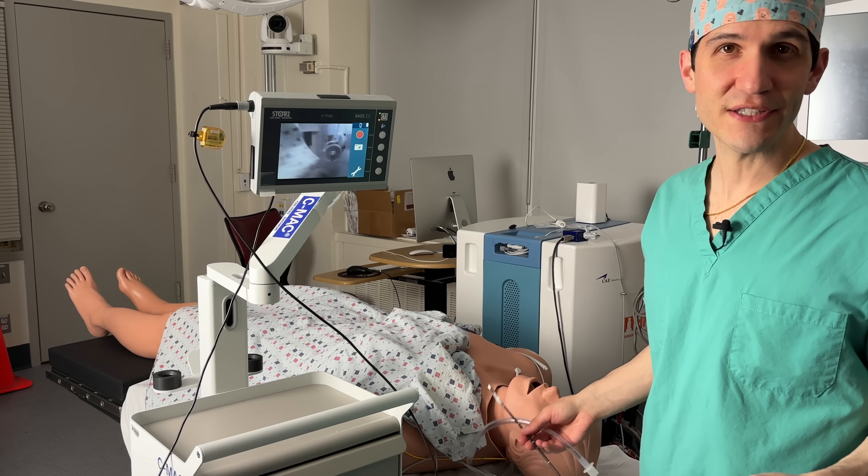Between setting patient expectations, a generous amount of lidocaine, plus or minus some sedation, it's definitely possible to help the patient feel very comfortable during an awake intubation. In fact, I once had a patient give me a thumbs up when we got the breathing tube right where it needed to be as I pushed the propofol to have them go off to sleep.